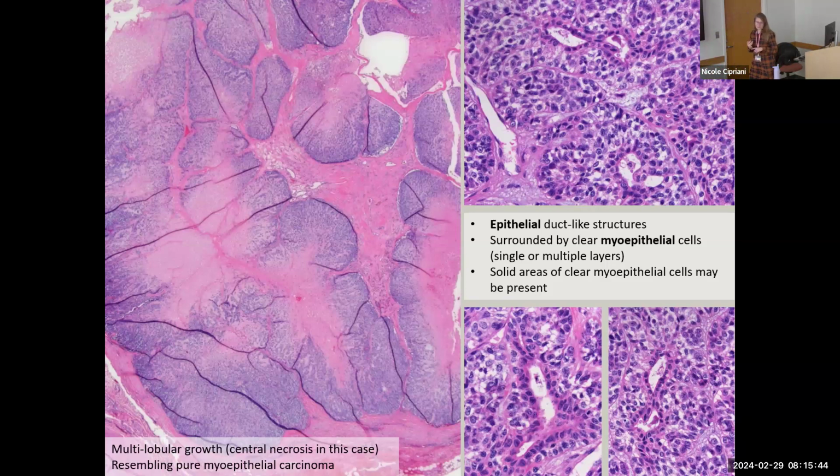You want to look for things like necrosis, mitoses, other features of malignancy or high grade to help your diagnosis. It's not adenoid cystic, right? When we think about biphasic tumors, it's not adenoid cystic because usually in adenoid cystic the nuclei are much smaller and wrinklier, and the pattern is different, right? We don't really see cribriforming here. We don't really see that bluish basement membrane material so much. So hopefully that makes sense.